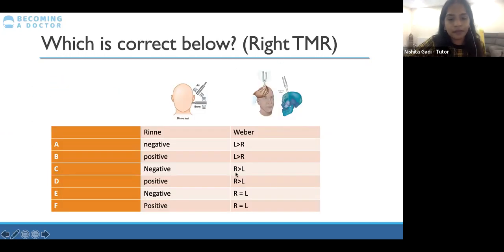So when you think about a tympanic membrane rupture, what is that? Is that conductive or sensorineural hearing loss? Conductive, yes, correct. So it's conductive hearing loss. So we'll go through it via that. Because we learned about Weber first, we'll see which one is better. Like we said, in conductive hearing loss, bone conduction is a lot better than air conduction in that ear. So that's why the bone conduction is better in the bad ear with the conductive hearing loss compared to the good ear, assuming that the good ear is normal.